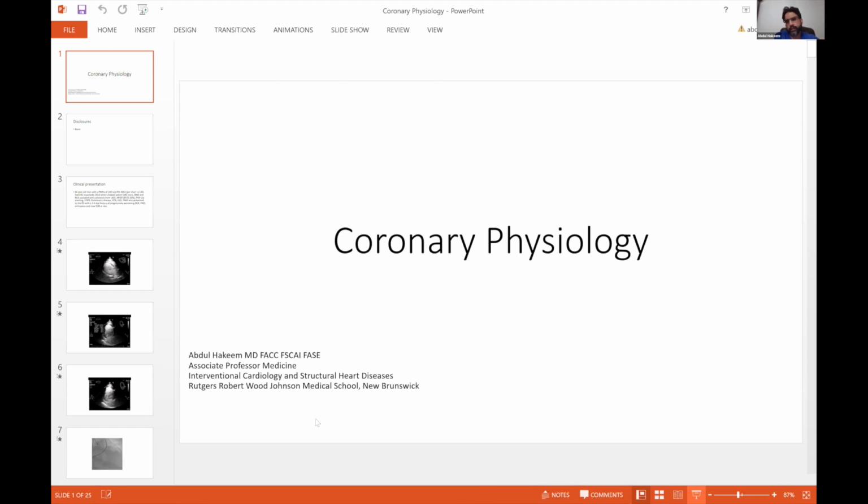Now, part of the reason why the LAD was non-ischemic was that a lot of that myocardium was probably infarcted. So if this was an LAD that was supplying completely viable myocardium, then for that 56% in-stent restenosis, we would have expected a truly ischemic response. Now, is there any evidence that fixing this would reverse his ischemic cardiomyopathy? As you know, with severe LV dysfunction and multi-vessel disease, I'm not sure how much evidence we have to really fine-tune that.